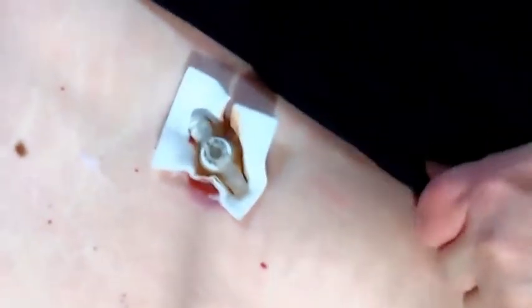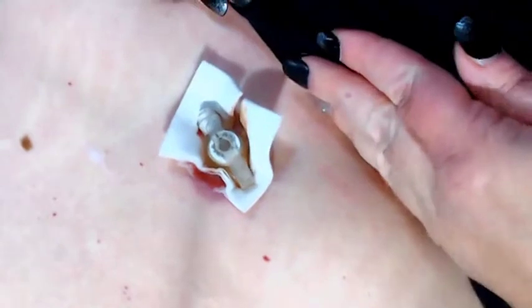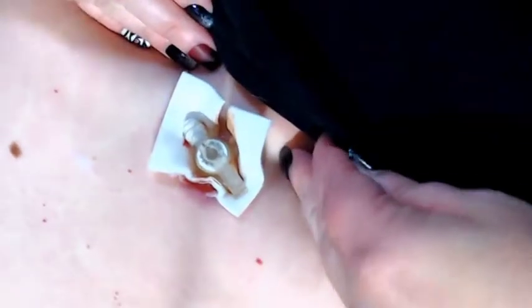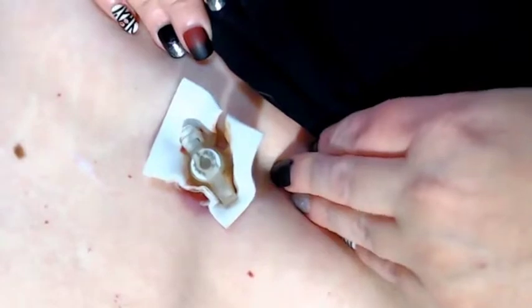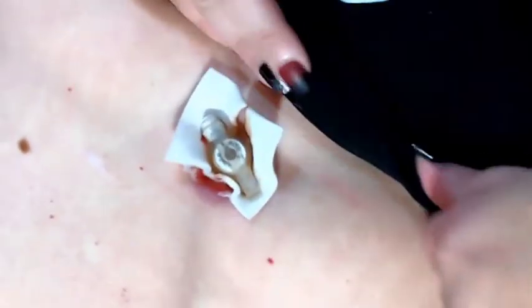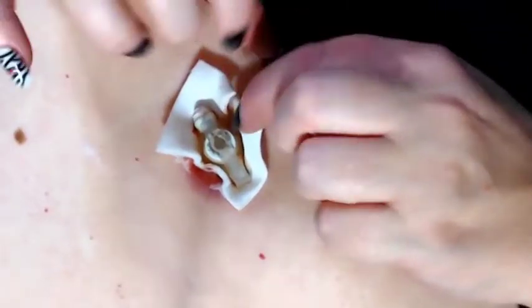And I can't pull my shirt up anymore because I would then be flashing you because my breasts are right here. This thing sits literally right under my breasts, which makes it pretty much impossible for me to wear a normal bra, like with an underwire, because it rubs on the feeding tube. So I have been wearing nothing but sports bras for, I guess, 2 years now.